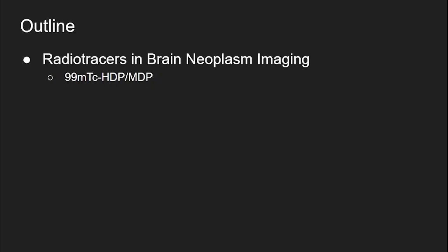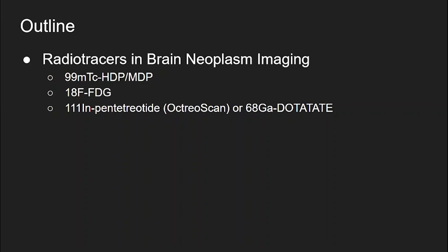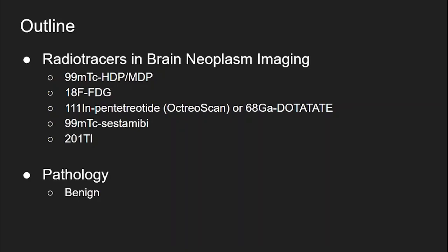HDP/MDP, 18F FDG, 111 indium pentetreotide or Octreoscan, or 68 gallium dotatate, 99m technetium sestamibi, and 201 thallium. The pathologies that I will be discussing today include benign and malignant tumors, including metastatic brain neoplasms.